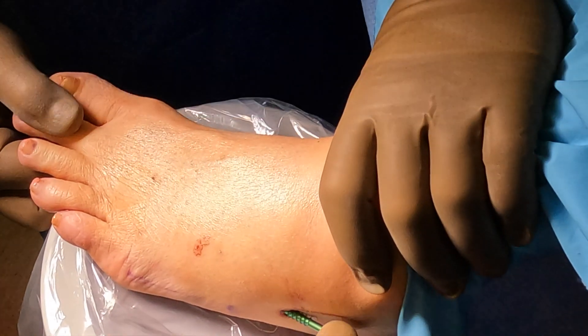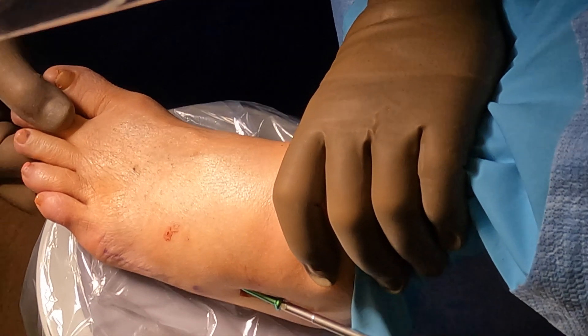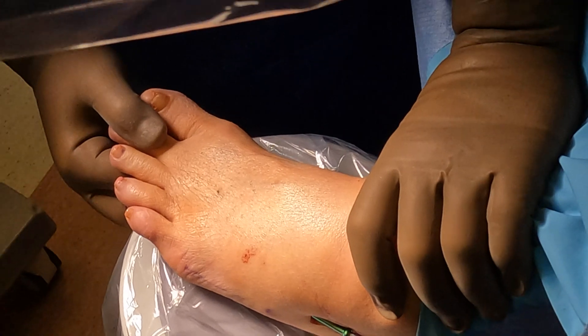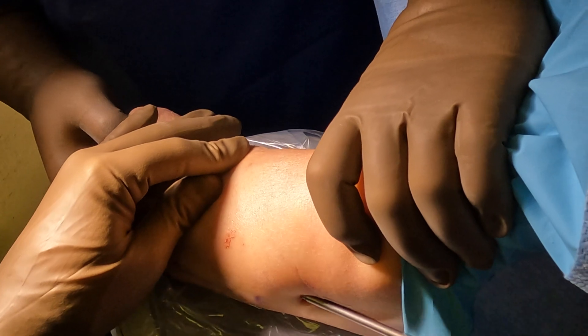Here's our screw. We had a guide wire, but this is a solid screw, so we're putting it right up against the metatarsal bone and inserting it down the medullary canal, which will stabilize the fracture of the metatarsal.